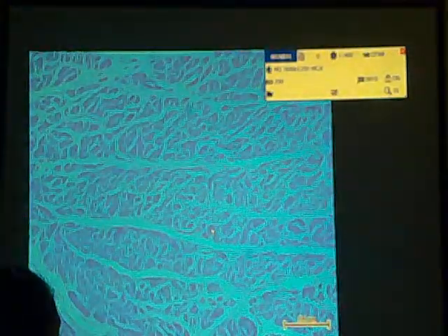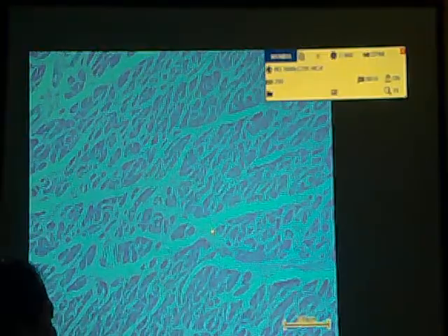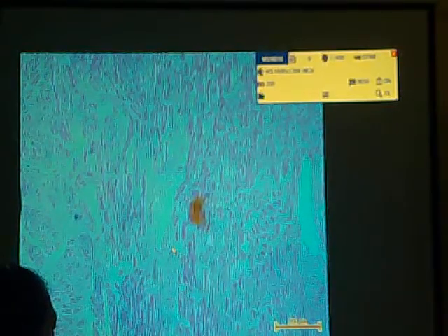Maybe we can go one by one, I will add. Of course, you will see it larger than the usual sizes of your myofibers here, cardiac fibers. Okay, so can you differentiate it from myoma? Can you identify or differentiate how a smooth muscle differs from a cardiac muscle?